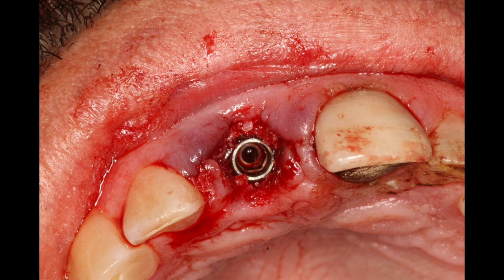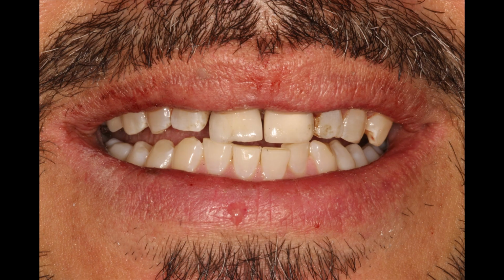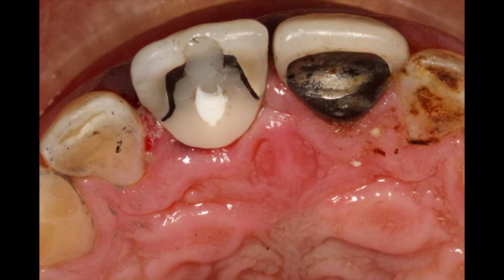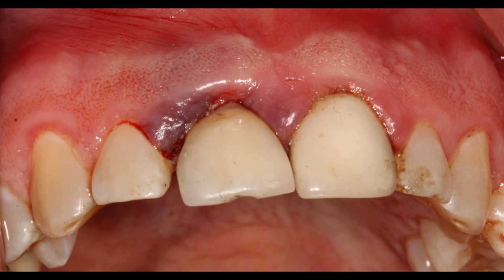And when you're placing this implant in here, it's going to be 3 millimeters beneath the CEJ of the adjacent teeth. And it's going to be, again, as we discussed, toward the palatal. All right, so this is a custom temporary. What you do is you use his own tooth to make the temporary. And I've shown this several times. There's a close-up of it because the body just loves the natural shape and the feel and the biology of the original tooth, even if it's a crown on there. There it is. You can see that it was indeed a crown, and we had to pretty much destroy the lingual, but then we just rebuilt it with composite. That's what it looks like on the facial.